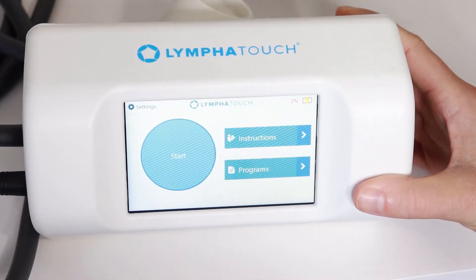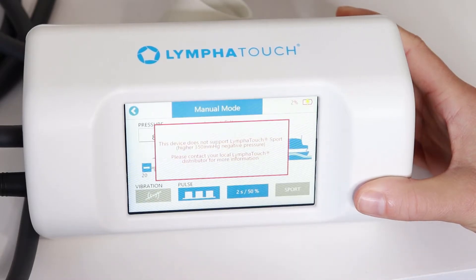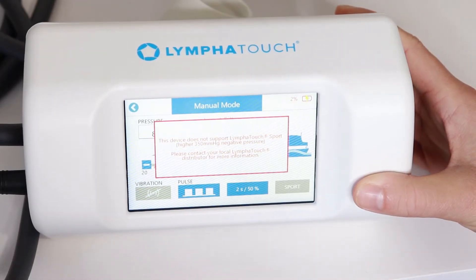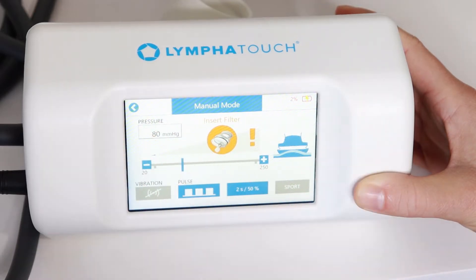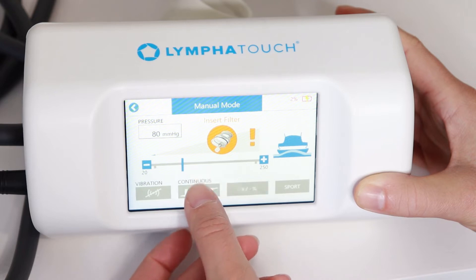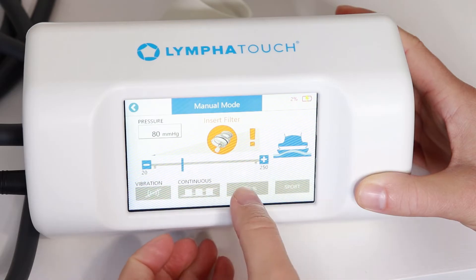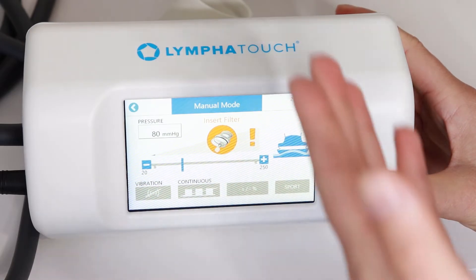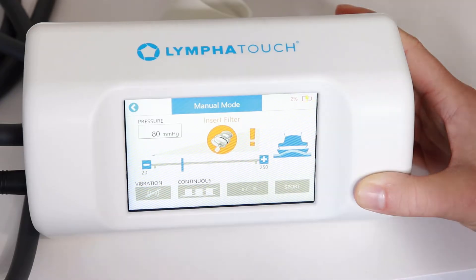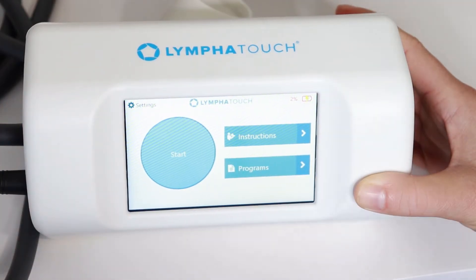Once past contraindications, we come to the settings page where we can just start if we know our protocol. We can pick our own amount of pressure, choose pulse — on and off — versus continuous suction, and there's a vibration piece. A therapist, physio, or even LymphoTouch itself might have prescribed someone a certain protocol to follow for a certain area.